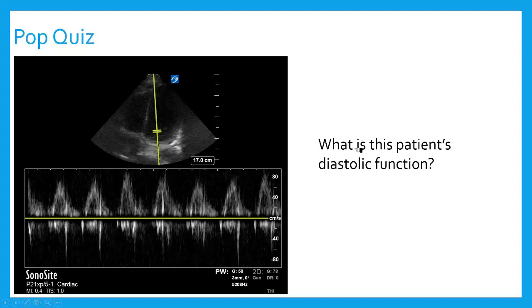Here's another patient where mitral inflow velocities were measured — but look where the sample box is placed: this is not even the right spot. And this patient doesn't really have any A waves. Maybe this patient is in AFib, or we just have the box in the wrong spot. The teaching point: I can't figure out diastolic function from this. You can't create useful diastolic information from junky images with just E waves.